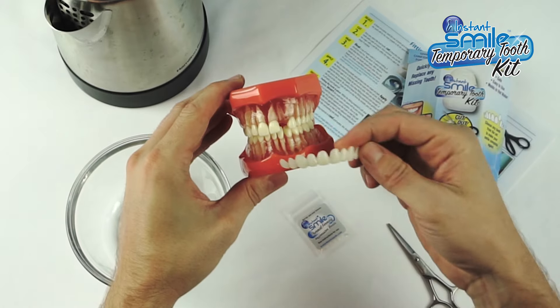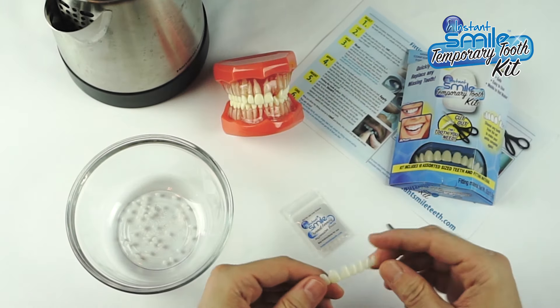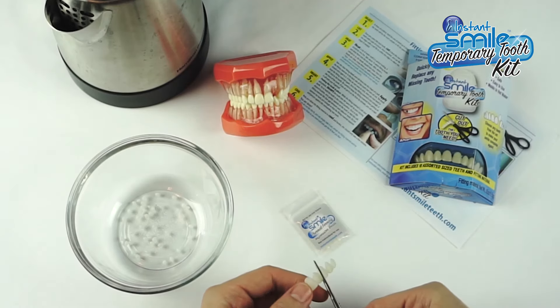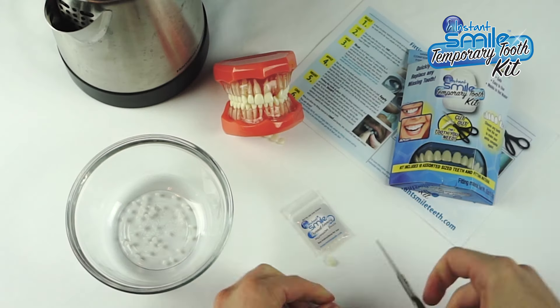The first step is to identify the size of your missing tooth. When you find the artificial tooth that is approximately the size of your missing tooth, simply remove it with a pair of scissors. In this case, it is the lateral tooth.